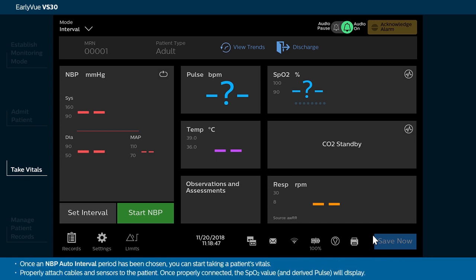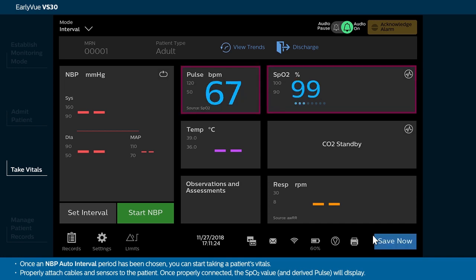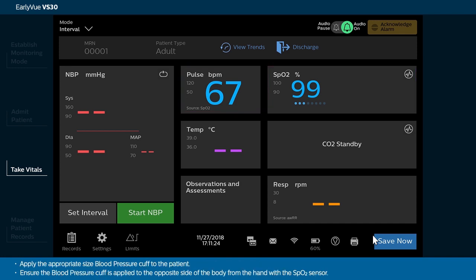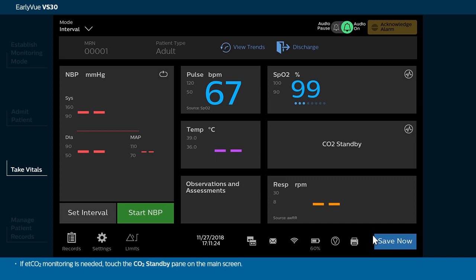Once an NBP auto interval period has been chosen, you can start taking a patient's vitals. Properly attach cables and sensors to the patient. Once properly connected, the SPO2 value and derived pulse will display. Apply the appropriate size blood pressure cuff to the patient. Ensure the blood pressure cuff is applied to the opposite side of the body from the hand with the SPO2 sensor.